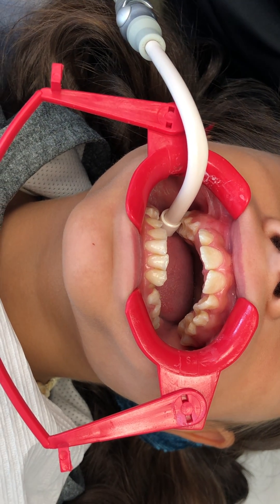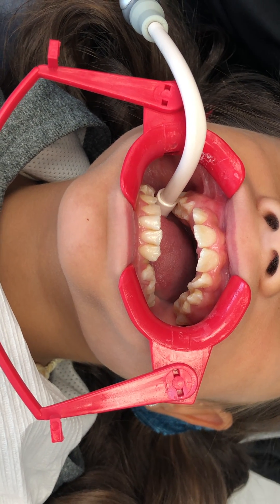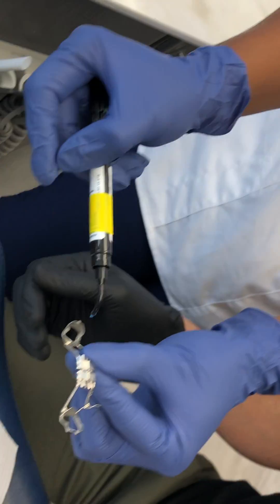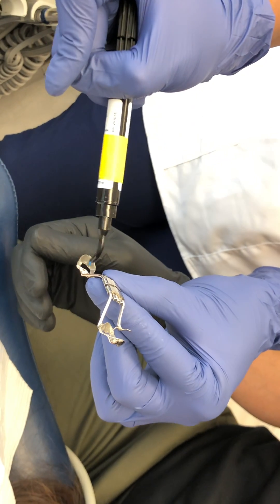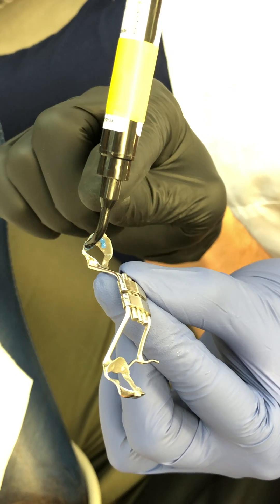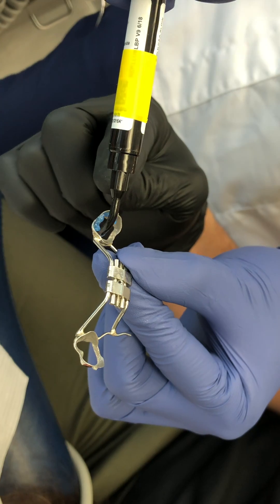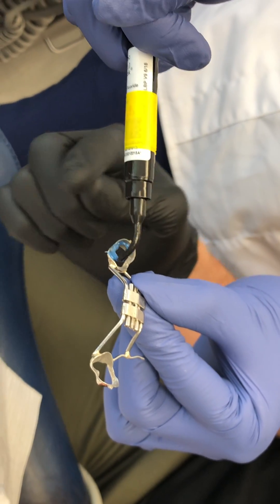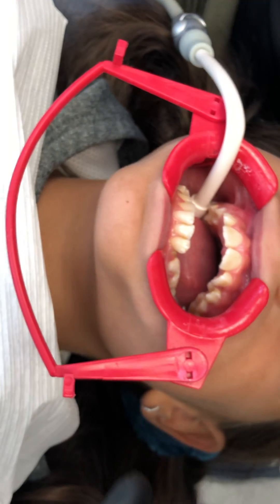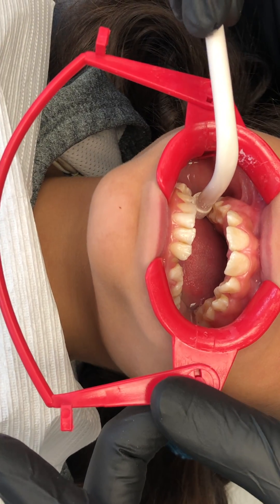We're going to rinse that off. Our assistant has already etched and applied the Assure — you can use Assure Plus too, either way it doesn't matter. We like these syringe tips for the Ultra BandLock Blue because it makes it easier to place the material rather than using a standard syringe. Now we're ready to rinse with a lot of water.